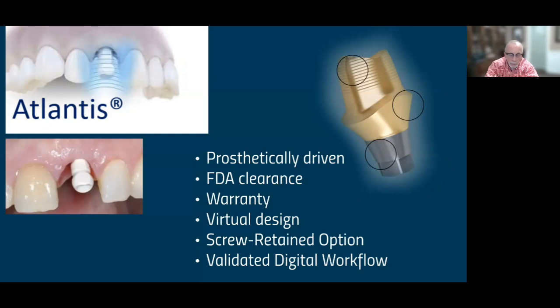And I'm a firm believer in planning for implants. Digital planning software today really, really helps us a lot. And I think even single tooth implants ought to be planned with digital data, meaning a cone beam and a scan. The scan can be an intraoral scan, but can also be a scan of a model, right? We can take that data, put it into the software, and it can help us determine that ideal placement for that implant, which is customization of the implant placement. And all of the planning software is restoratively driven, meaning it's going to figure out, of course, where the bone and the nerves and everything is so that the implant goes in the right spot, but it's also going to figure out where it needs to be and what angle it needs to be to support the restoration we want to put in the spot.